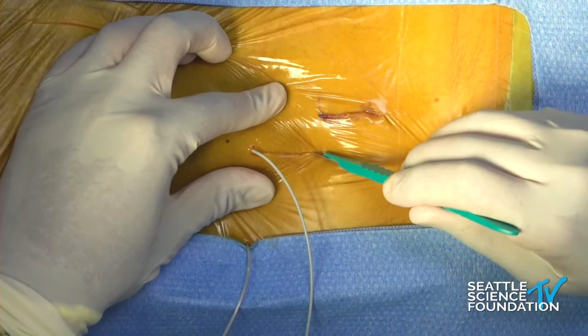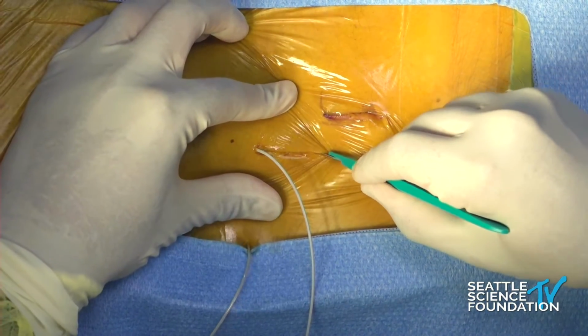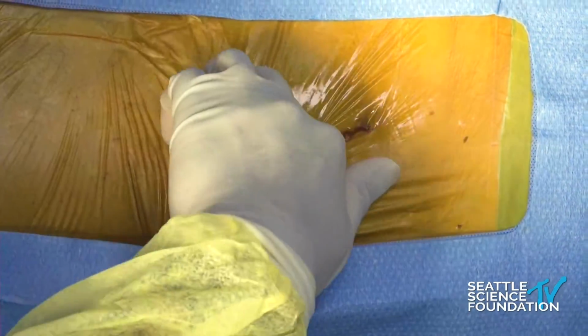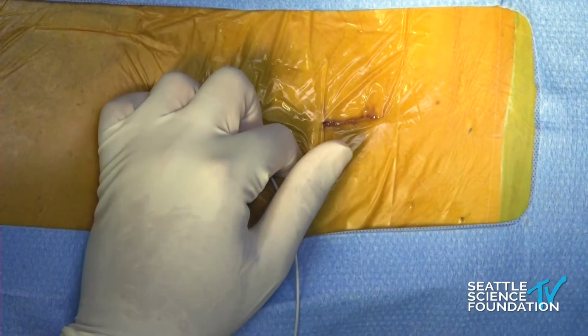And we want to make sure that the leads don't migrate. What we used to do, and some people still do this, is incise directly onto the IPG. The issue with that is you can actually create some tugging or pulling. So I don't personally do that. So I try to make sure my IPG pocket is quite good.